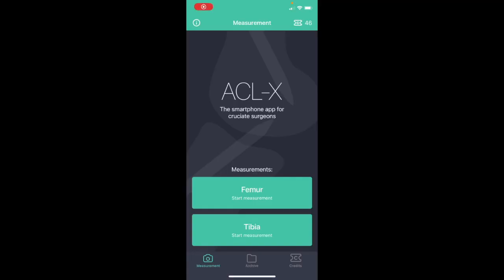Hello everybody, I would like to demonstrate ACLX, which is a smartphone app for ACL surgeons.